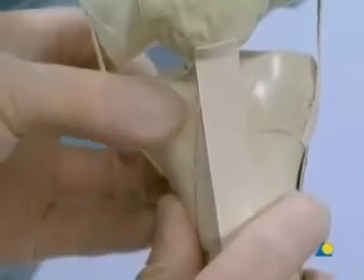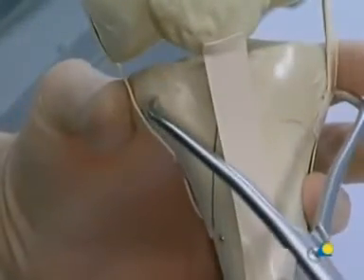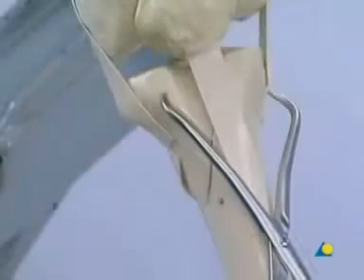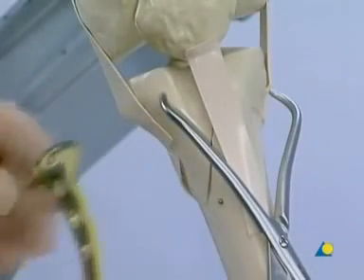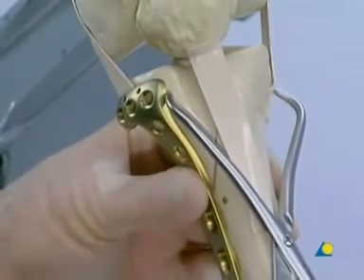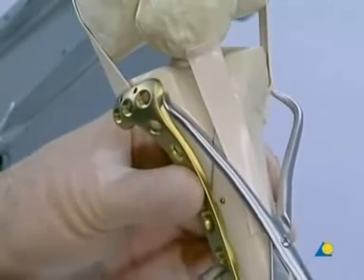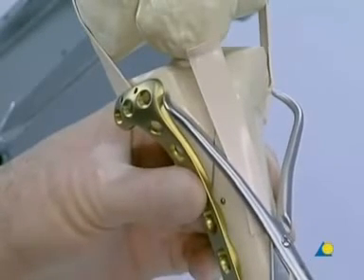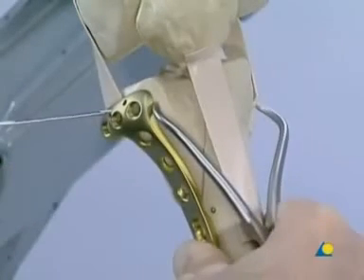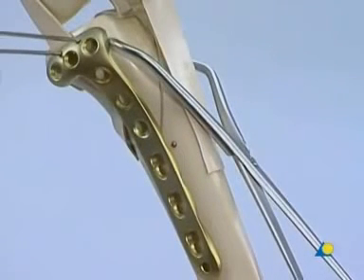After reducing the lateral construct, the reduction is held in place using the large pointed reduction forceps. A 4.5/5.0 LCP proximal tibial plate is placed to support the lateral condyle by buttressing it. Alternatively, either a T-buttress plate or a tibial head buttress plate can be used. The LCP is fixed temporarily with 2 K-wires, as shown here.